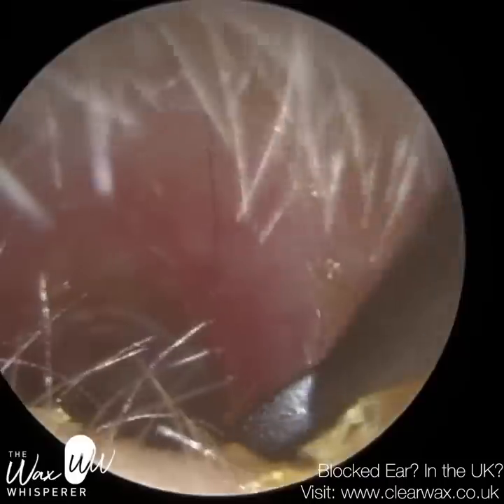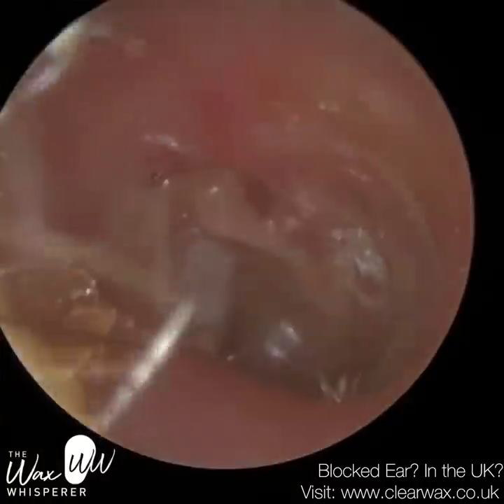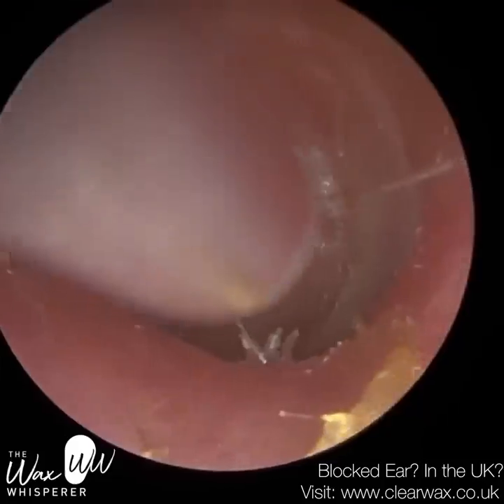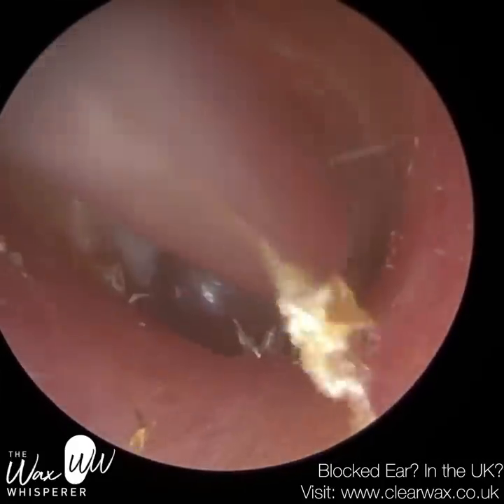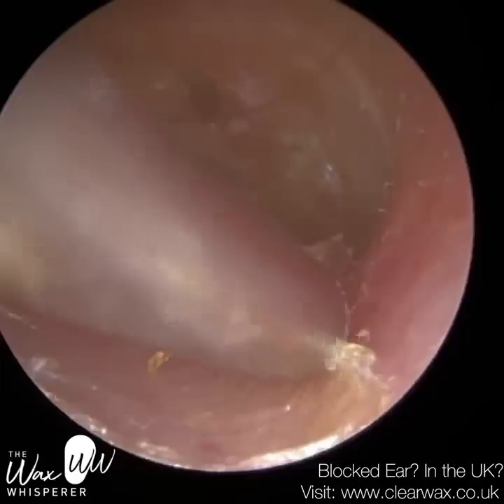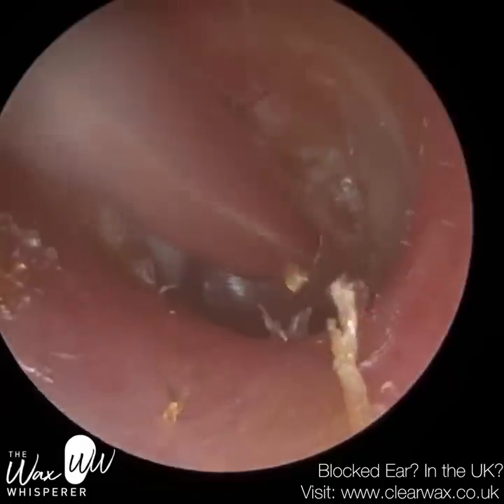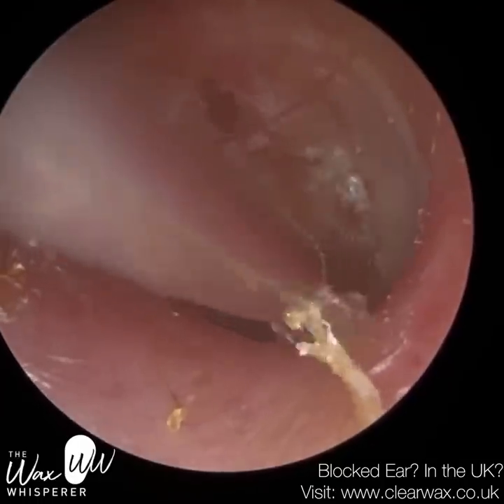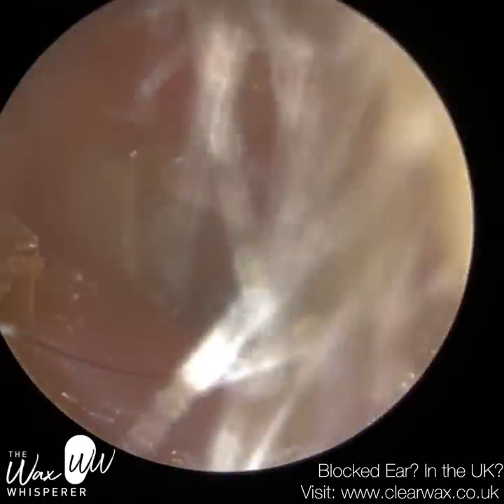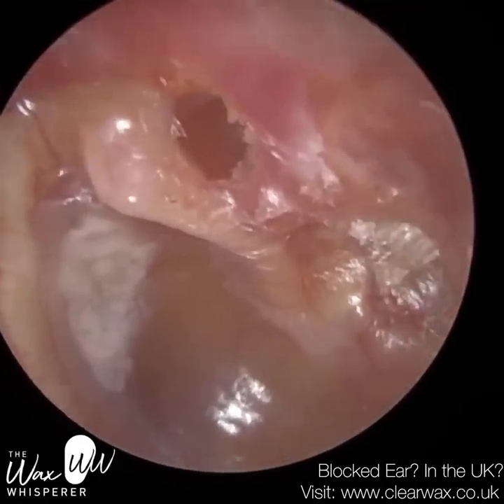So given this patient's history, I've written to the patient's GP. Although I'm really happy with what we've done, we want to be safe — this patient has previous cholesteatoma surgery, so I think they just need to see ENT again. We've made that referral. It's just a bit of residual dead skin here that I'm peeling away. I'm not overly concerned about that — I'm more concerned about the skin near the eardrum; that's the area of concern.